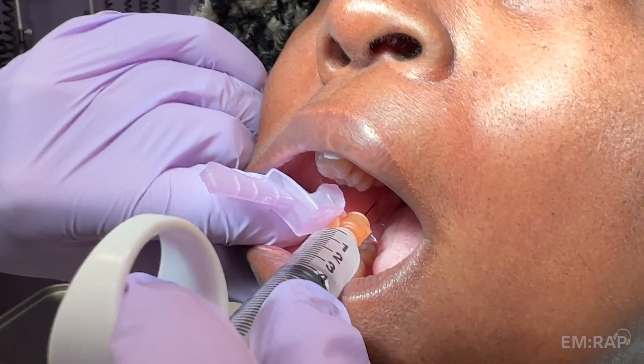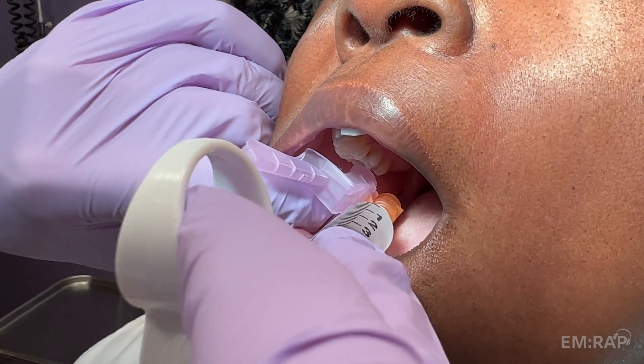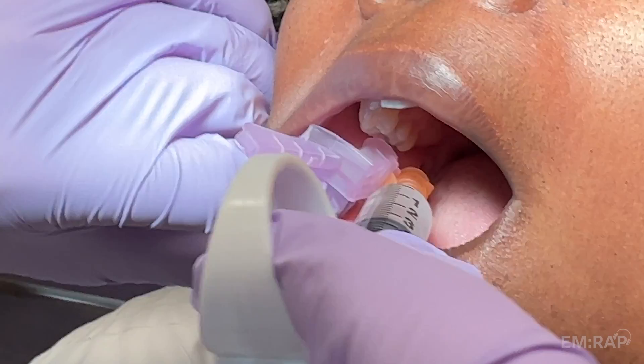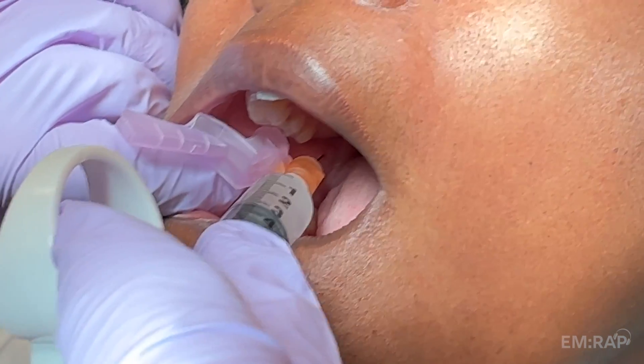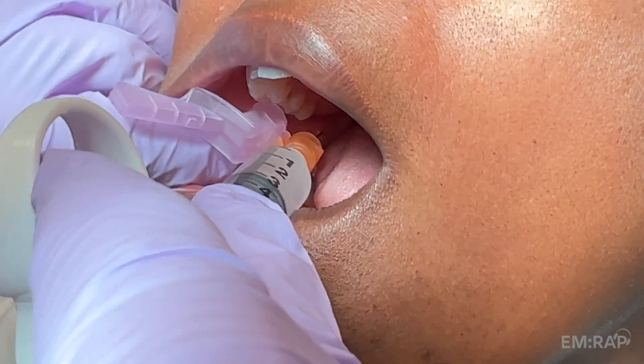If you don't touch bone, you're likely too lateral and you might be in the parotid gland. Withdraw the needle slightly, aspirate, and inject 1-2 mLs of local anesthetic.